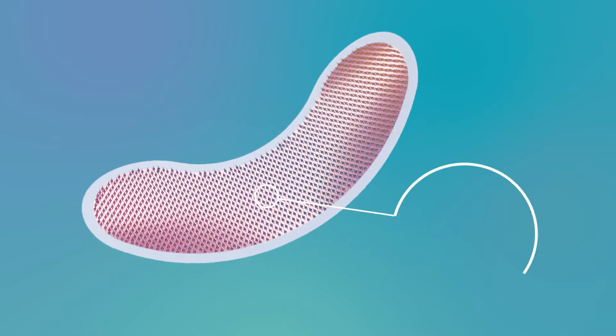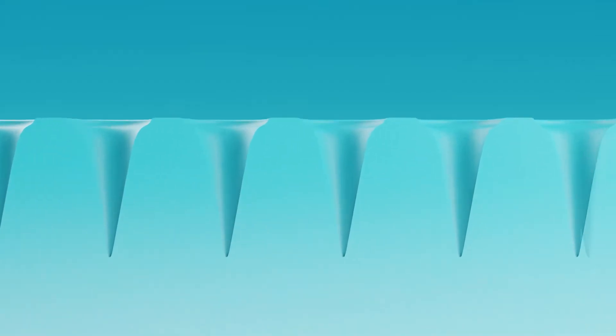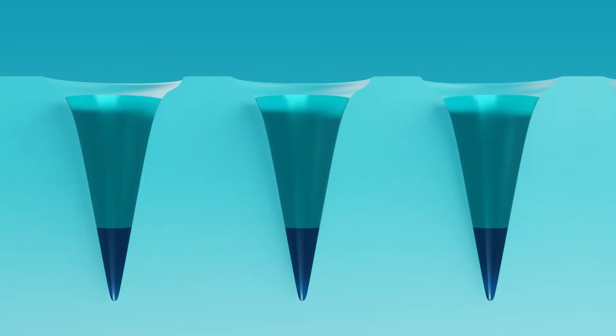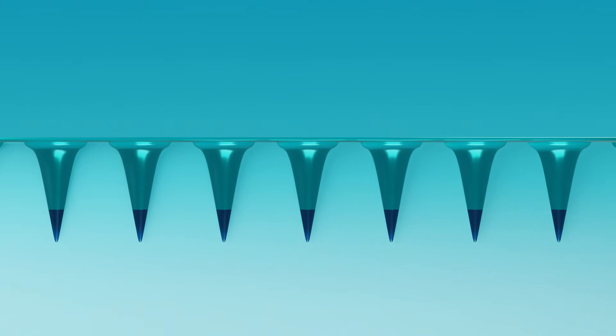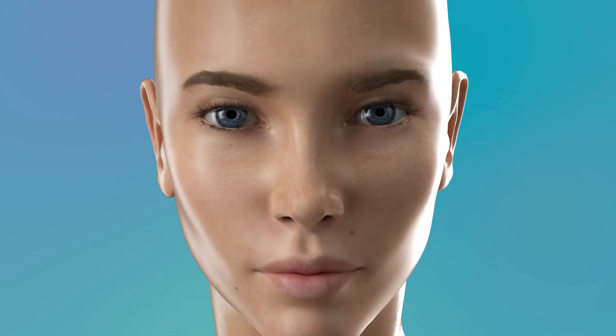To create our micro needles, we use a micro molding technique. We place active ingredients dissolved in low molecular hyaluronic acid into the tips of the molds, then fill the molds with middle-weight hyaluronic acid on top. We place a supporting tape, and after polymerization, we take out the patch — it is ready for use.